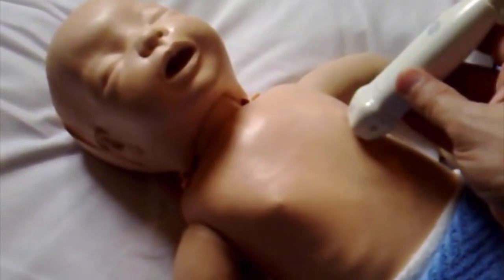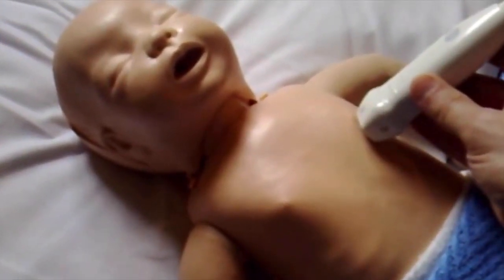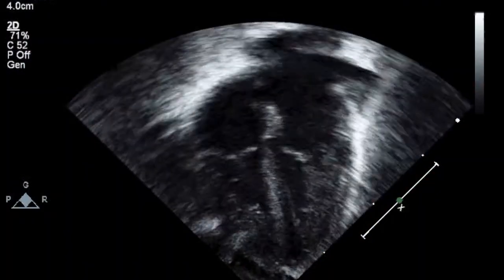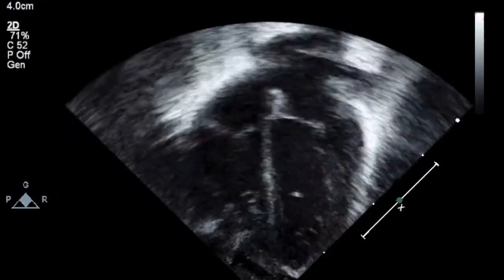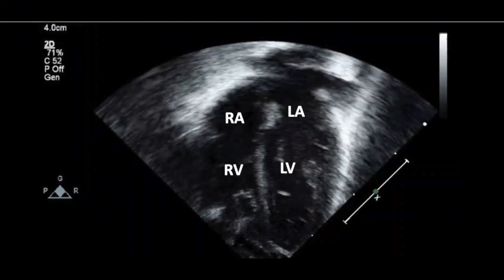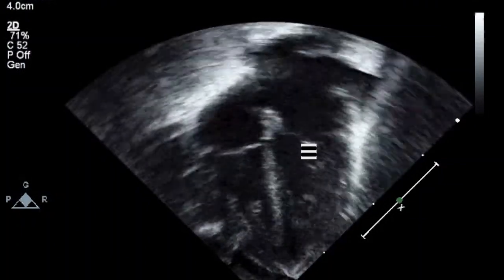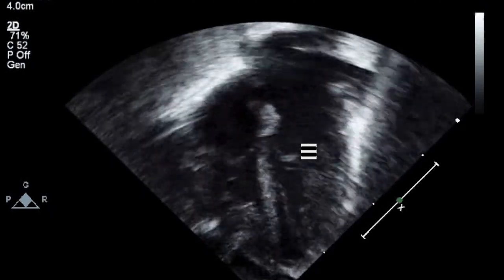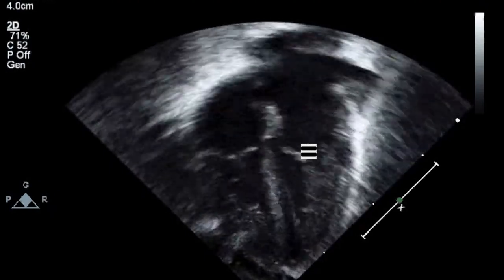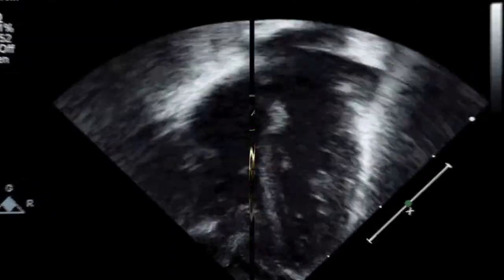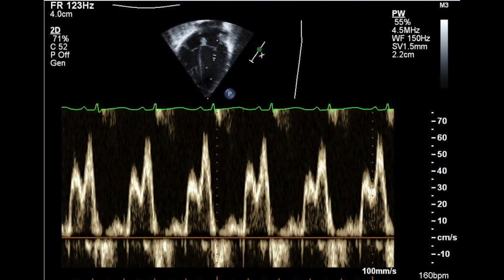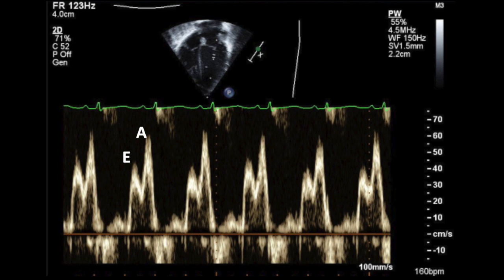First, we have to get a good apical four-chamber view. This is where we put the probe, with the pointer on the left. This is the four-chamber view with labels on the picture — LA and LV are on the left and RA and RV are on the right side. This is where we put the sample gate for the PW, the pulse wave Doppler, just below the mitral valve. This is the Doppler tracing we're going to get: the first wave is the E, or early diastole, and the second one is A, or basically atrial contraction or atrial kick.